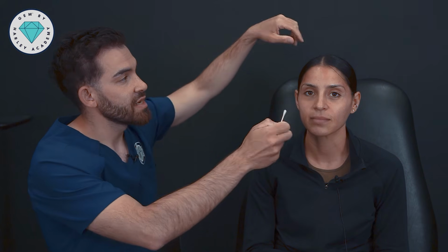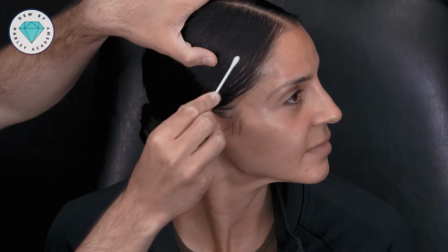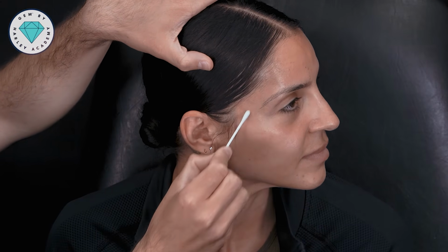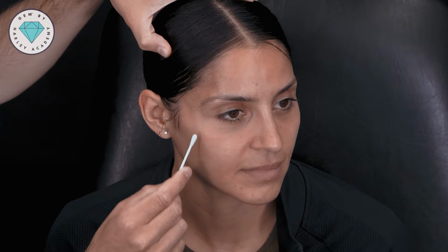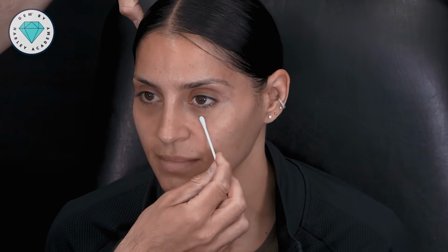So let's take a look at this. If we just zoom in on the face a little, I'm going to just show you what I see from this side. So turn all the way this way. I'm really happy with this really beautiful convexity from the filler in the forehead and the volume in the temples. It's kind of supported the periorbital area entirely. This is now what it looks like when the filler settles at the cheek, at the apex of the cheek and the under eye. There's no irregularity. There's no swelling or puffiness under the eye. So it's completely undetectable from looking at it even this close up that there's been any filler treatments.